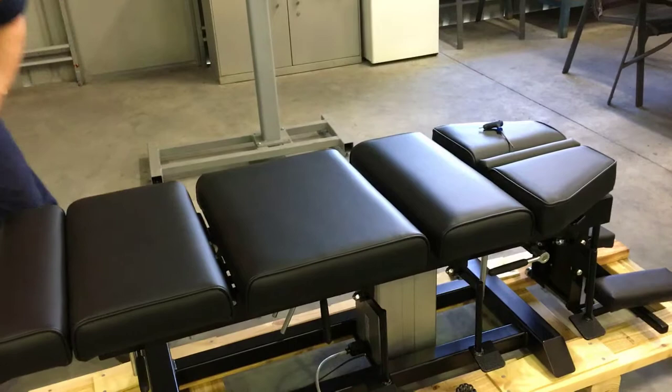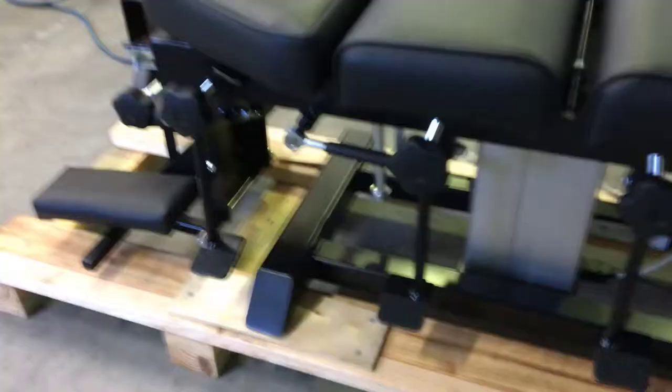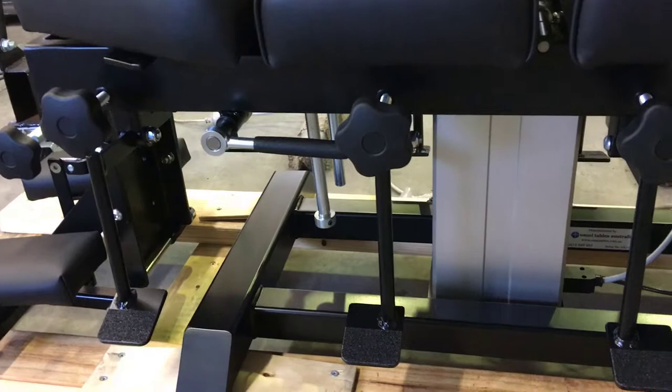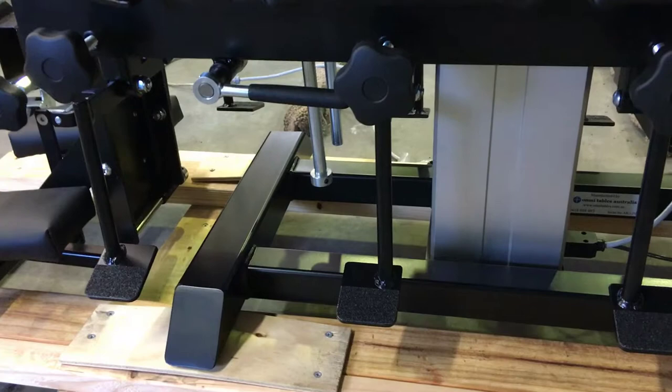And there you are — simple process, just a matter of replacing the headpiece and you have a table converted from stationary to elevation. Please note: if you're moving from a larger table to a smaller table, you will have the correct length pedals included in your package. Make sure the pedals are the correct length — if you've got longer pedals, they can hit the floor and actually start to raise the base. You don't want that, as it damages the pedals, table, and also the actuator. So just make sure you replace your pedals.